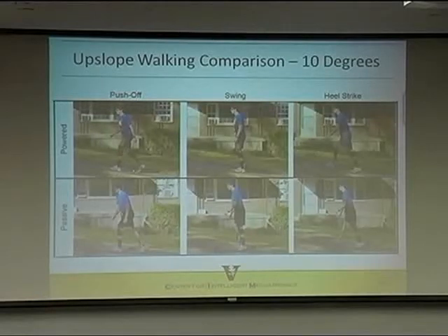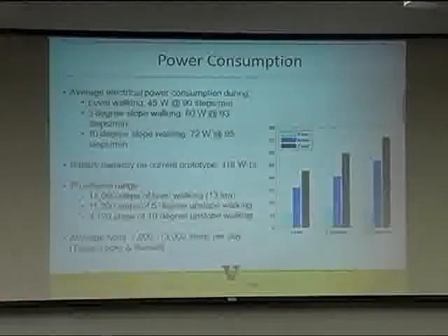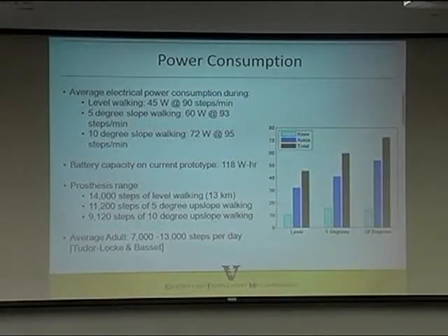If you look at our leg, here you're getting this full-powered push-off. So his stance leg is flat on the ground here, because he doesn't have to worry about it not swinging high enough. And then when he hits the ground, he can hit with the knee bent at an angle there. He's kind of pushing off here, but he's not having to compensate in other strange ways, and he can take a bigger stride also. So basically in the uphill also, we're able to restore what we consider to be fairly healthy biomechanics.